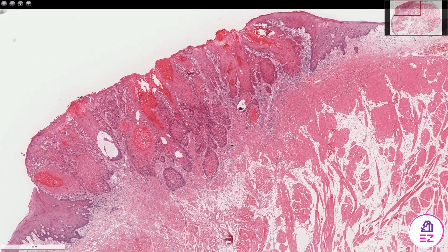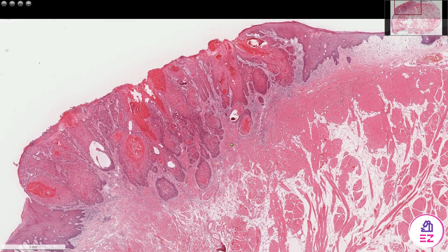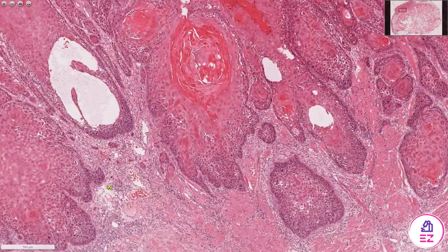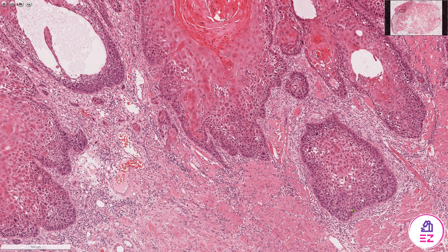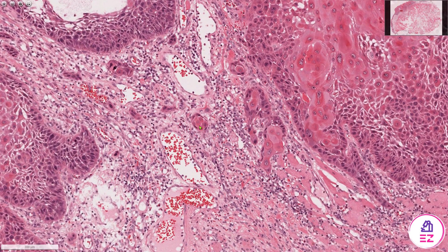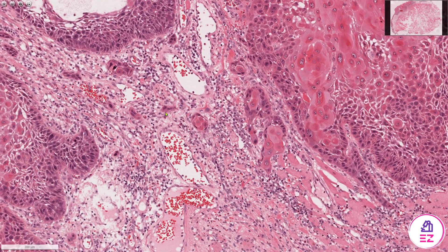We'd also look at the host response and whether there's any stromal desmoplasia. Another key thing would be the pattern of invasion — is it invading in large cohesive groups, or in this case we can see a discohesive pattern, as there are in places just one or two cells forming these small islands.